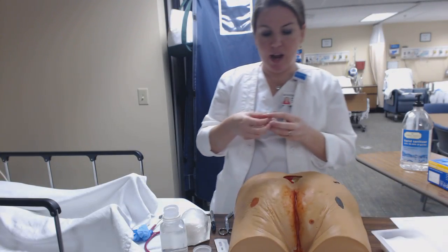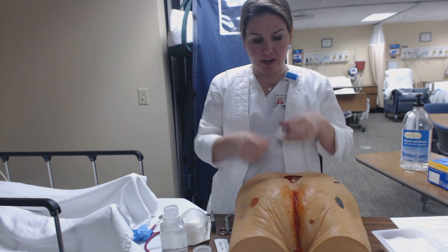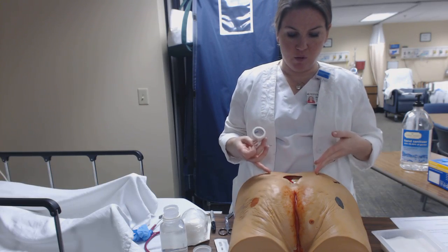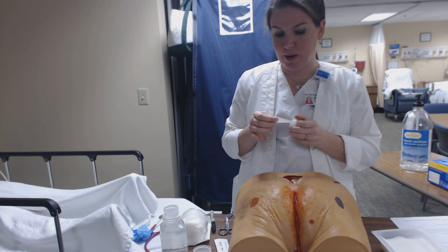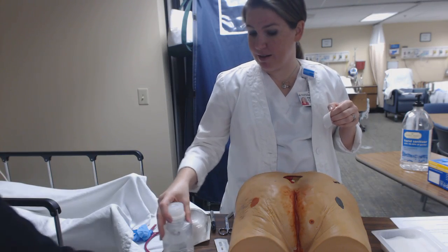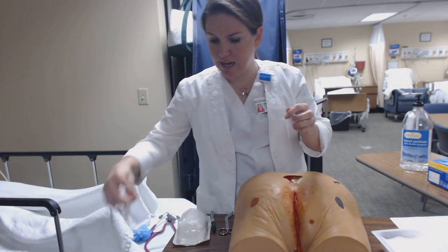No, it's not nice. So it's also very unprofessional. So I'm going to, ahead of time, take my piece of tape off and mark it. I also know that I'm going to want 4 pieces of tape to window pane my dressing. So I'm just going to get those ready now because that's my preference. And I should have probably put the cap back on there. Okay, so I'm just going to set these here.